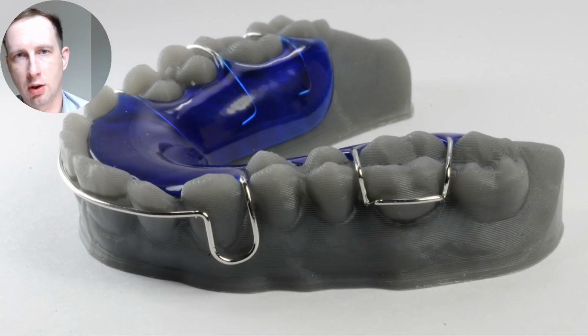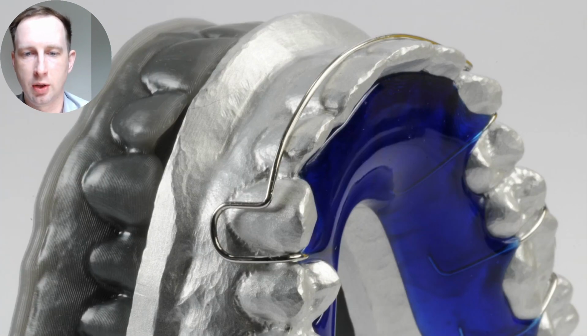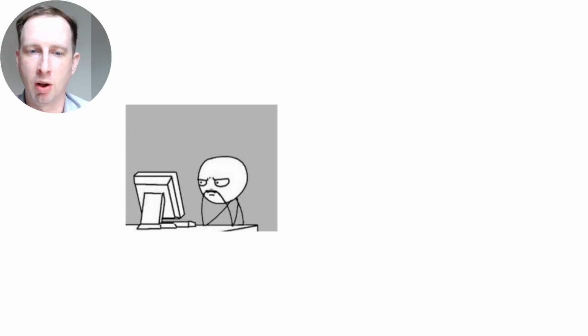We also did testing for traditionally made orthodontic appliances like Hawleys. Here's a Hawley made on the printed Draft 200 part, and then we fit it back to the master model. Again, it absolutely fit like a glove. Beautiful.